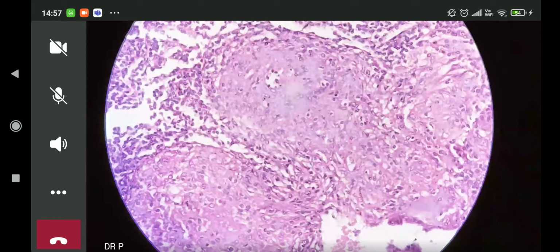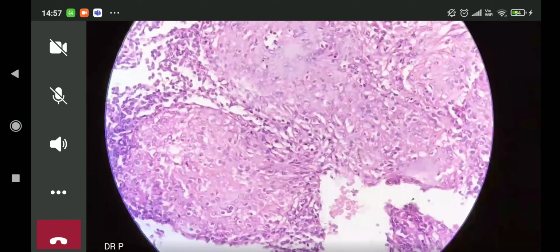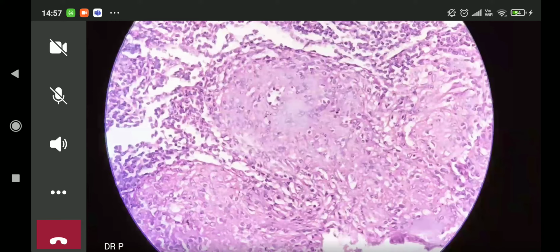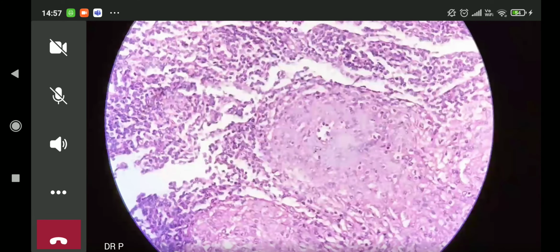Now over here on top, you have these blue dots, right? These are lymphocytes. Now you want to ask me, where are the histiocytes, right? Because I'm saying that these are a collection of histiocytes. Now you have to understand, first of all, that there's a difference in the color of what's happening. On the upper side, all of these are lymphocytes.